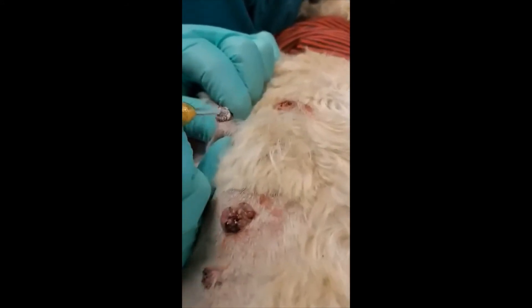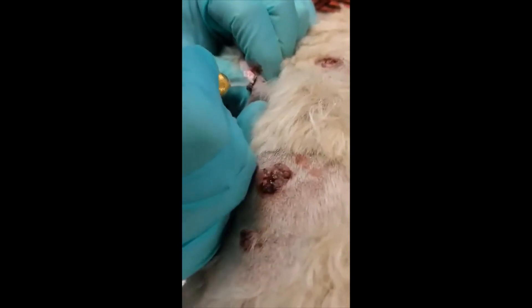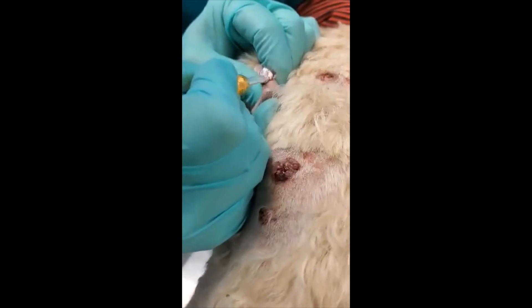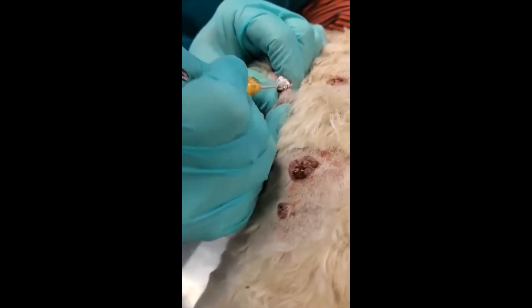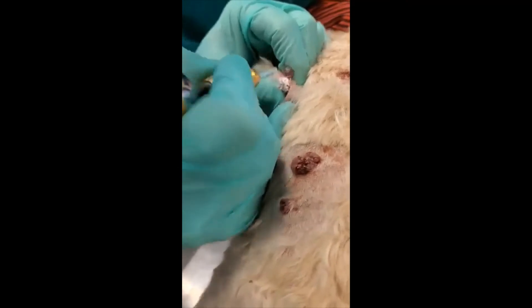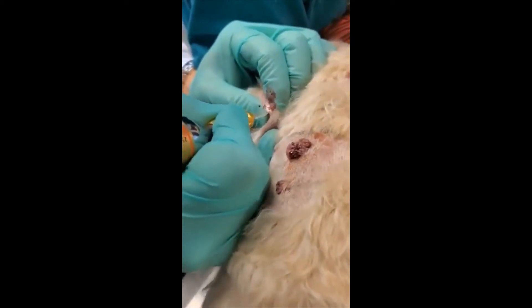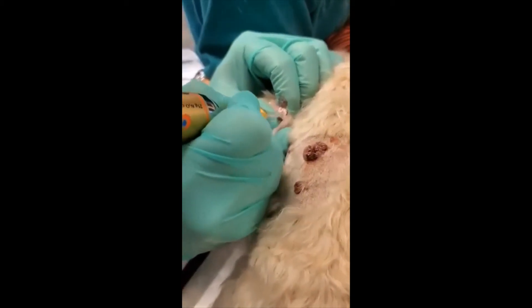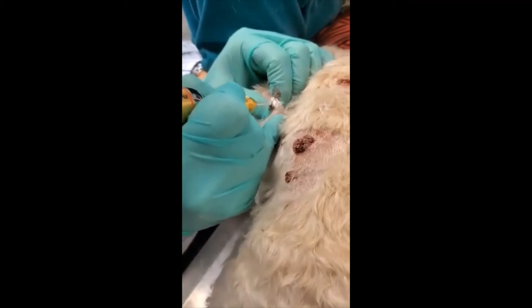We're going to go ahead and refreeze these for 30 seconds. I find that the fleshy masses do require a double-freeze cycle to cause complete regression. Typically, I recheck these in three weeks, and if at three weeks there's any remaining tissue, I will touch it up at no charge to the client.